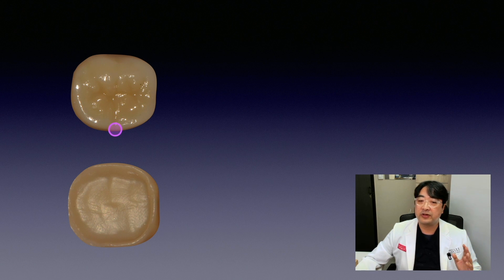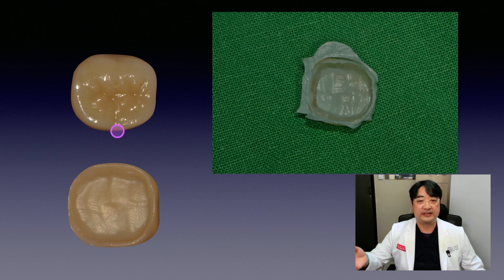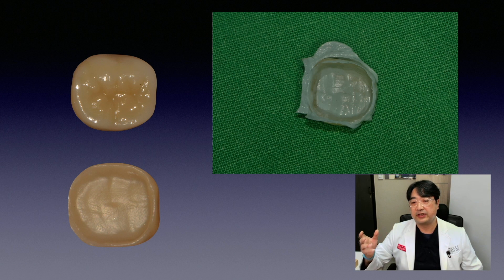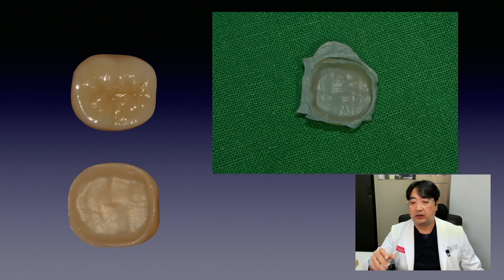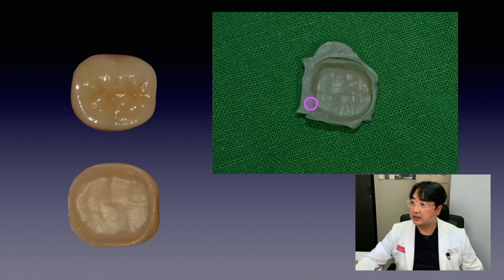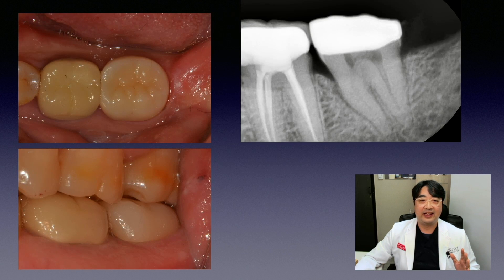I tried the crown in the patient's mouth and checked it with the fit checker. For tooth-colored restorations like zirconia or ceramic, I use the fit checker with a drop of caries detector, because it makes it easier to detect bindings. As you can see here, there are some bindings on the mesial surface. However, you should be careful when reading the fit checker — these bindings are not from the internal surface of the abutment; you can see the margin is open, meaning you need to adjust the proximal contact before adjusting the internal surface. After adjustment of the mesial contact, the fit of the crown was good without any interference, so I went ahead and cemented the crown.